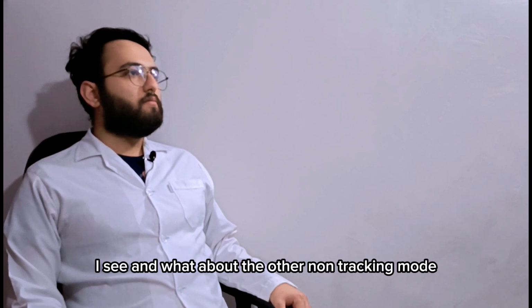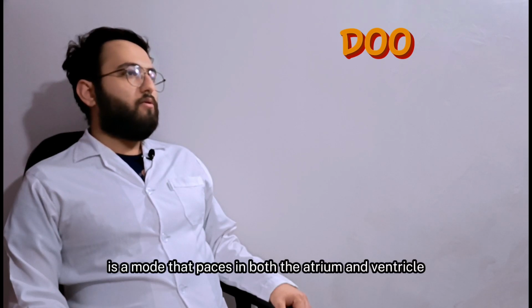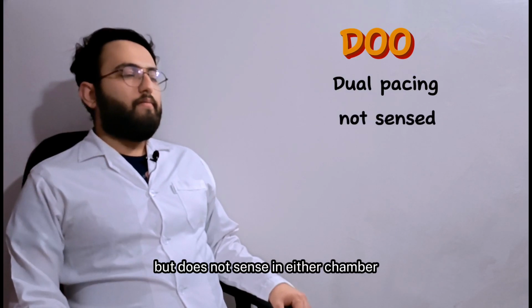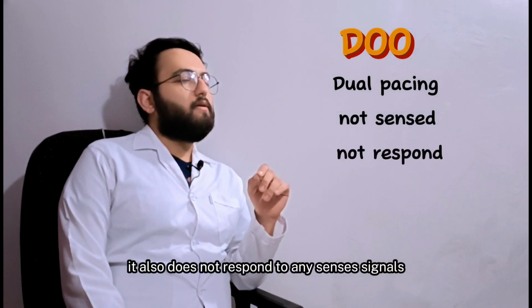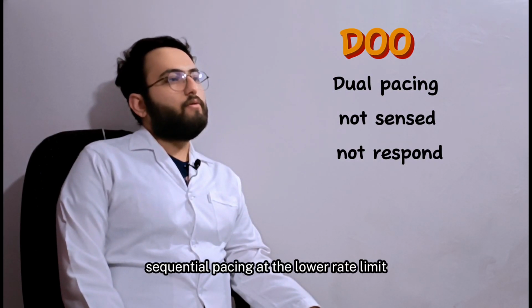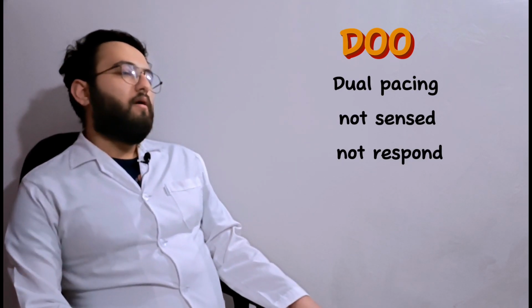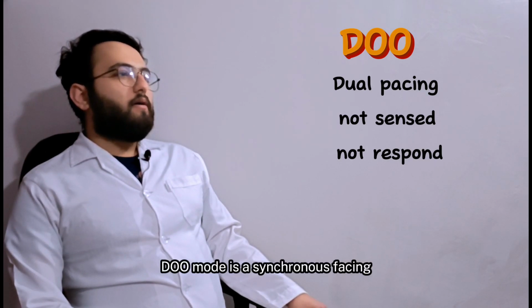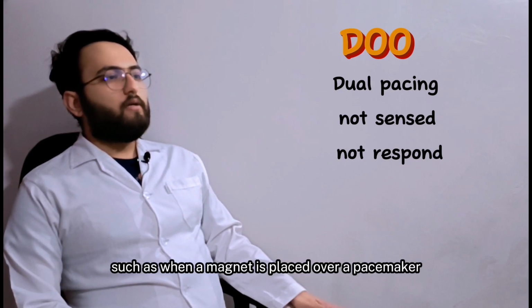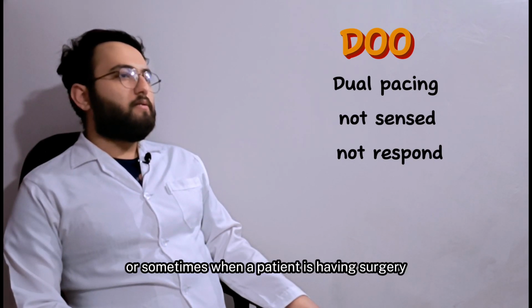I see. And what about the other non-tracking mode, DOO? DOO is a mode that paces in both the atrium and ventricle, but does not sense in either chamber. It also does not respond to any sensed signals. This mode results in AV sequential pacing at the lower rate limit, regardless of the heart's own intrinsic activity. DOO mode is asynchronous pacing and is usually used only in certain situations, such as when a magnet is placed over a pacemaker or sometimes when a patient is having surgery.